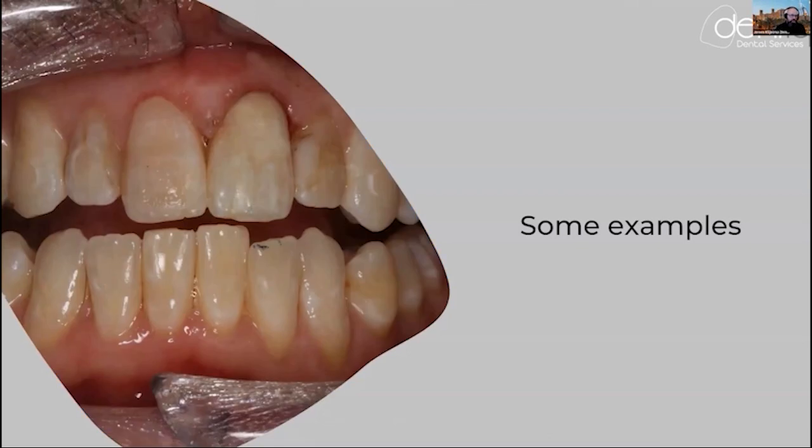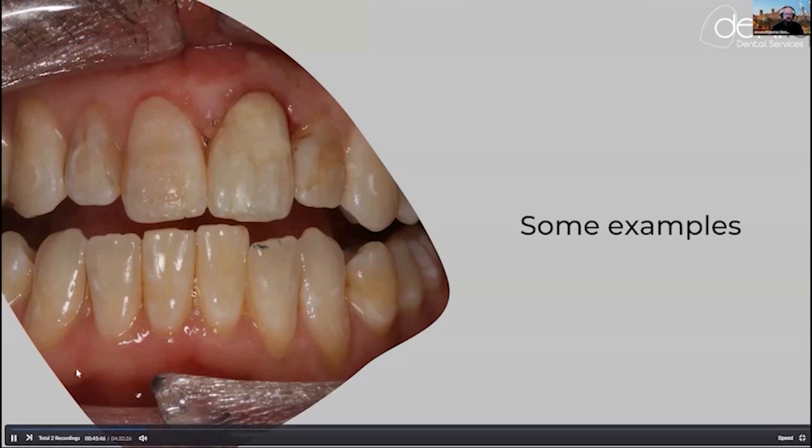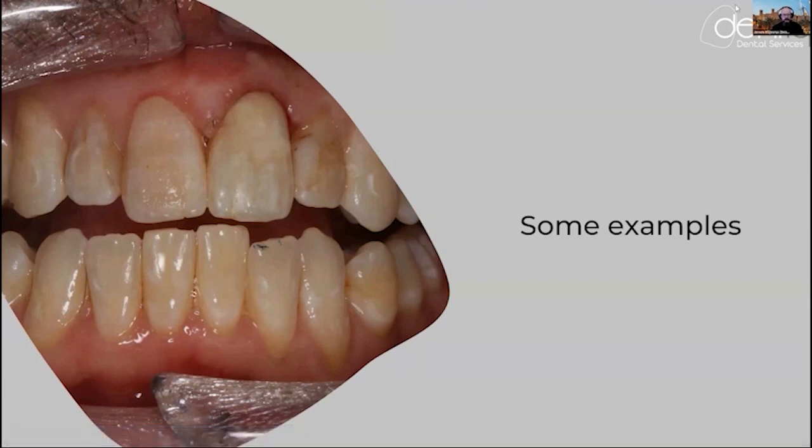The other thing I have, for example, is here we see a crown on the 2-1. And it is just a crown. This will stay a year and a half to probably 2 years inside the mouth, and then we're going to replace it with a final one. But for a 3D printed crown, with just a little bit of stain and glaze, I think we've got a beautiful solution. Whoever says 3D printing and aesthetics are not there, I think I've proven different in this case. So we are really redefining 3D printing and dentistry, what we can do now with additive manufacturing.